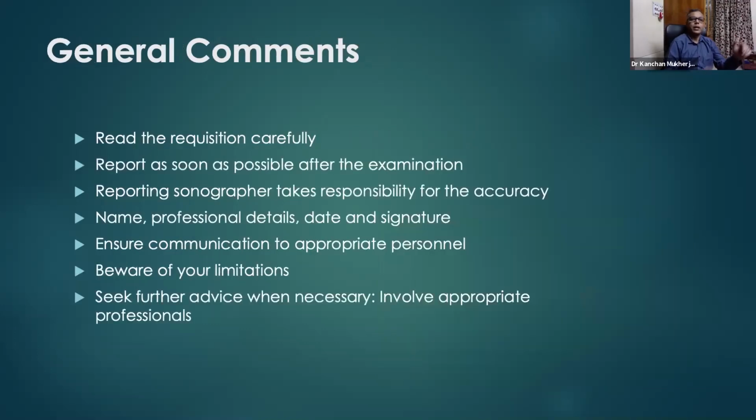Right. Now I have some general comments to make. First thing is, before you start scanning, you read the requisition clearly. I think that is where many of us go wrong. A 35 weeks lady appears in your scan room and you presume it's a growth scan. And you don't read the requisition. The clinician might have asked some specific questions for you to answer. And if you don't read the requisition, how would you know?